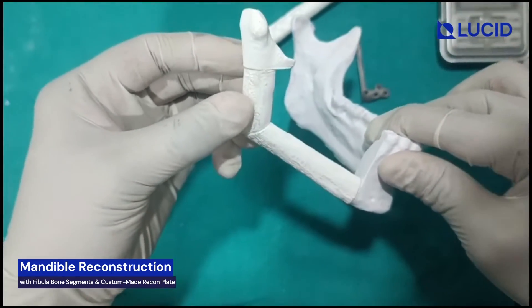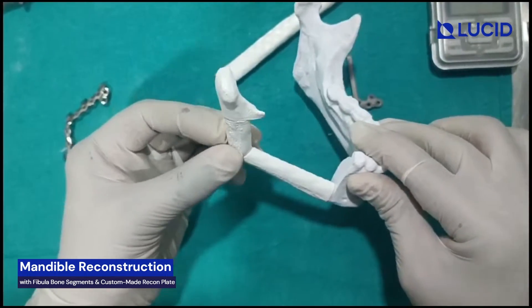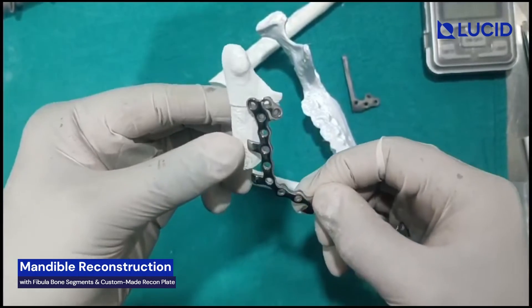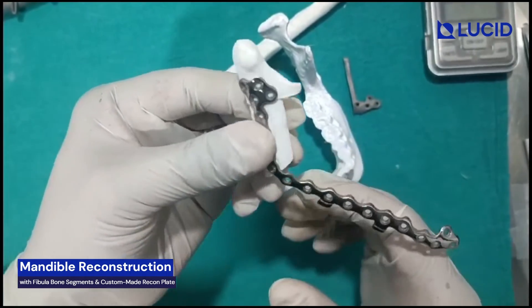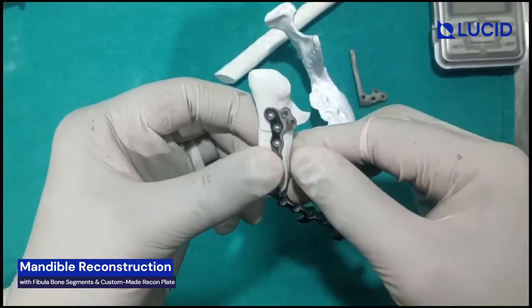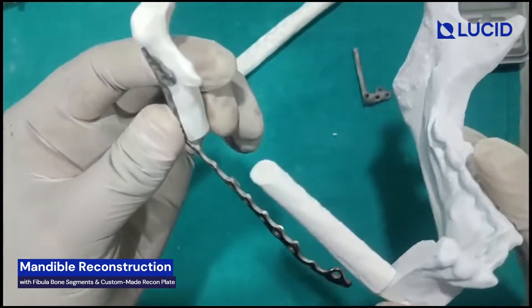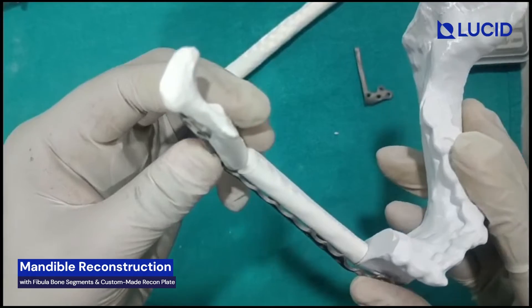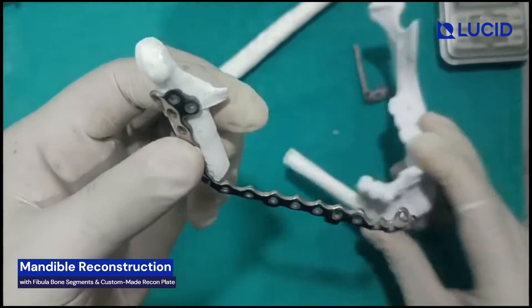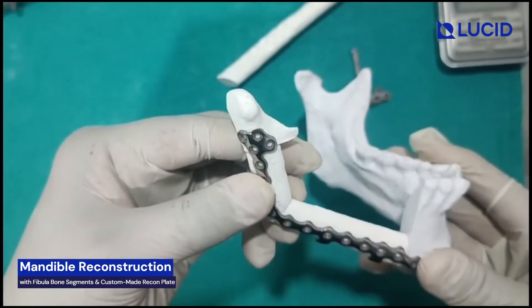Now these two pieces will be aligned and fixed like this. But this has to be fixed with the help of a recon plate. This is the mirror-finished outside recon plate with matte finish from inside, and you can see this is how it will be placed here. Four screws over here. You have to use bicortical screws around 10mm in length, and in sequence you have to start placing these screws — this will get attached over here in this fashion.